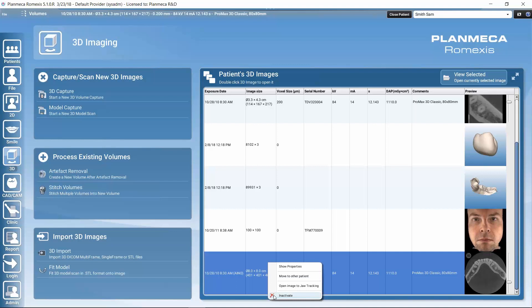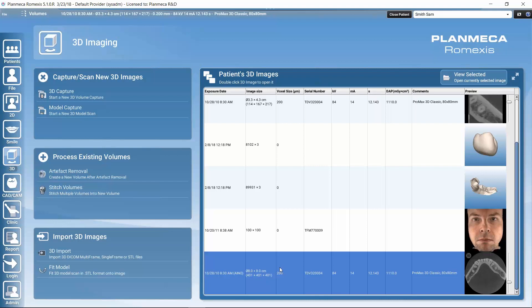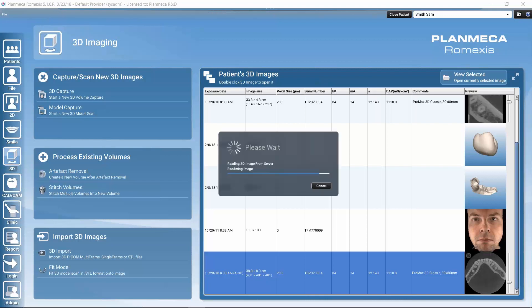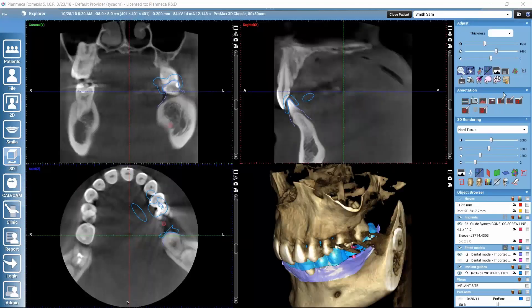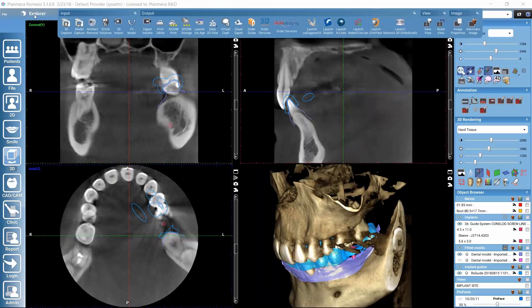We can also inactivate the image, which removes it from the patient's image list, but we don't lose the image completely — we can always retrieve it back to RomeXis through the RomeXis configuration application. We can open any of these image entries by double-clicking on it. After opening an image, just like after capturing or importing, it gets opened in the Explorer submodule.